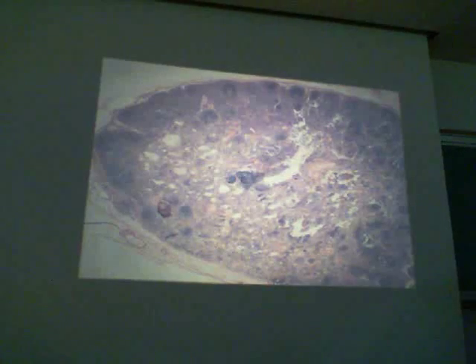What is this organ? Lymph node. Good. And so out here we have what portion of the lymph node? Cortex. And down in here we have the medulla. What are these things out here? The entire thing would be what? Lymphatic nodule, and the pale center area would be a germinal center. And out here, what is that line that we see? Okay, that's the capsule.